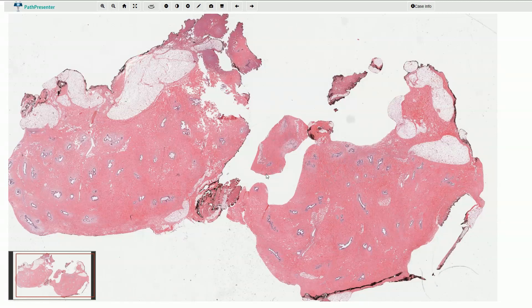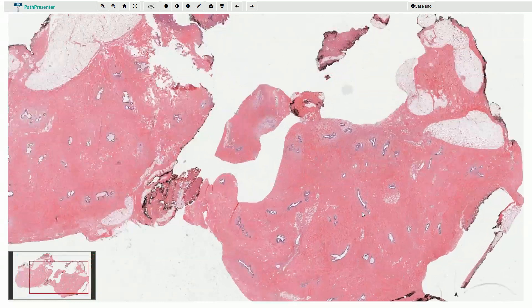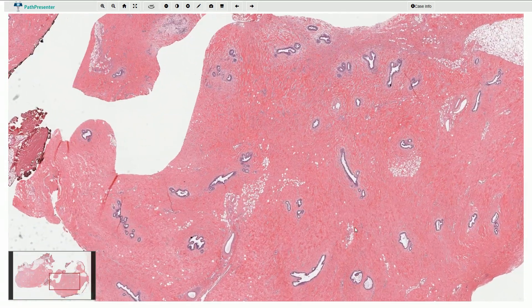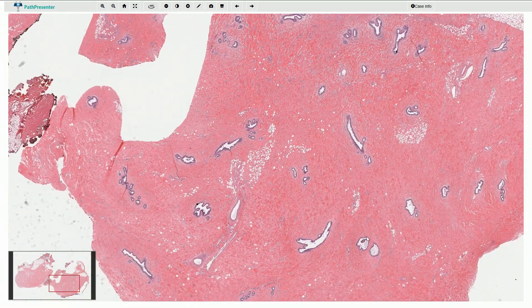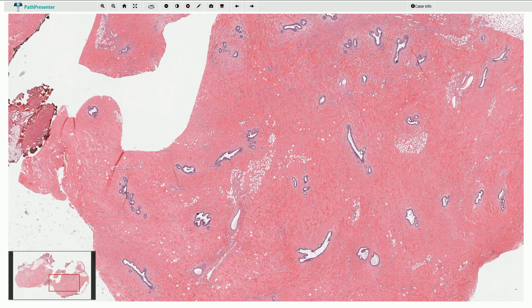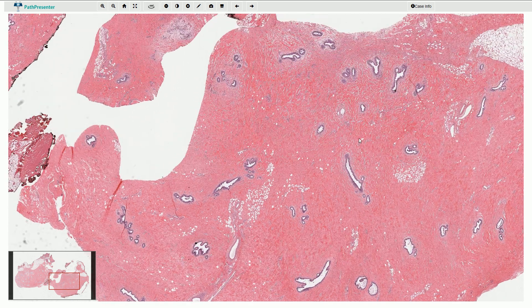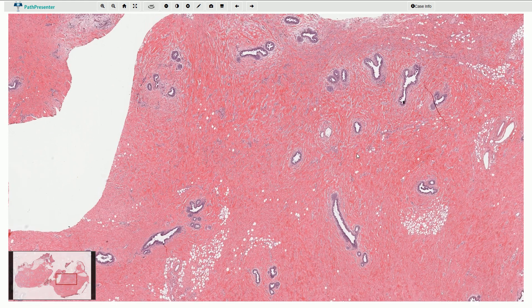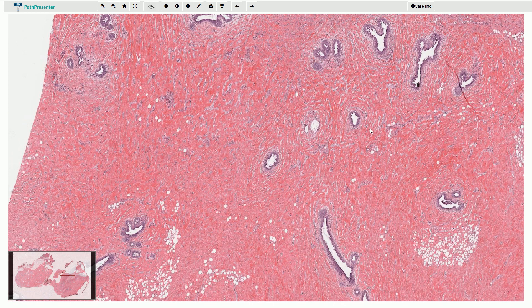Here we are looking at a sample of breast tissue. There are foci of adipose tissue here, here and here. We also see quite prominent fibrosis with multiple ducts, and those ducts are slightly irregular. Some of them are cystically dilated, and typically we do not recognize normal terminal duct lobular units as we would expect to see in normal breast tissue.